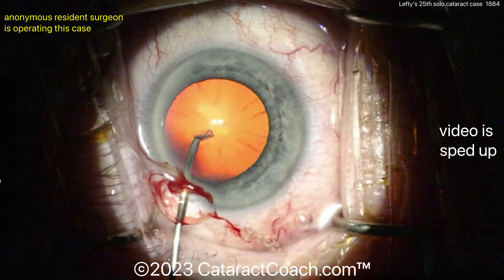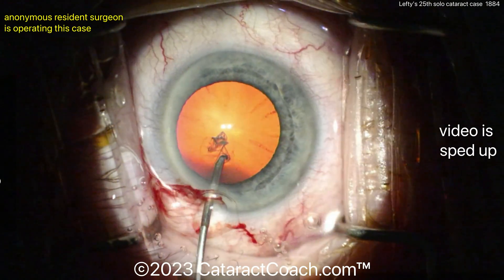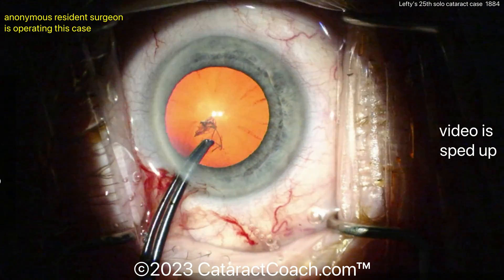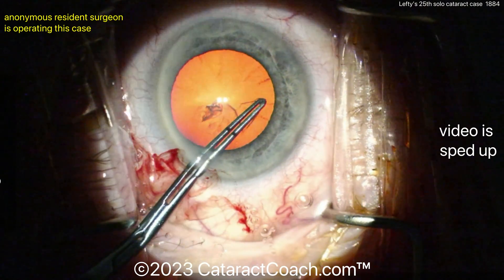You need to have a little bit of paraxial lighting too. So have the coaxial — great red reflex, makes the visualization easy — but also get at least a little bit of the paraxial lighting going on so you're not operating in the dark.